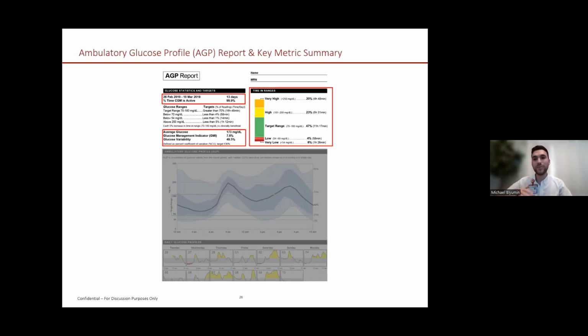They're very variable. So, this person might be experiencing low blood sugar, they might be experiencing very high blood sugar. On average, it is at goal, but really throughout the day, it's probably not at goal. So another reason why these CGMs are so valuable. Then on this side, we see the time in target range. The time in target range here is 47%. So lower than you would like. We want to see it above 70% depending on your goal. And so we can interpret kind of what's been going on throughout the day there.